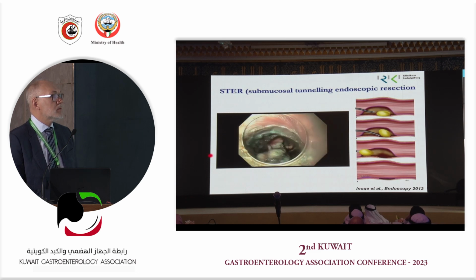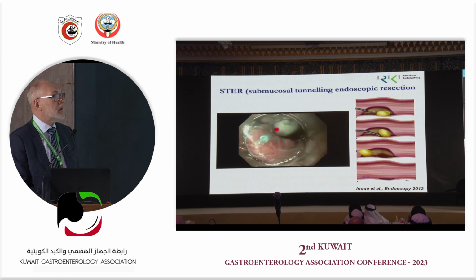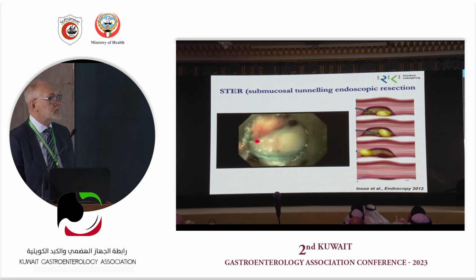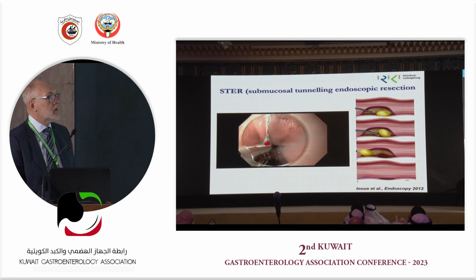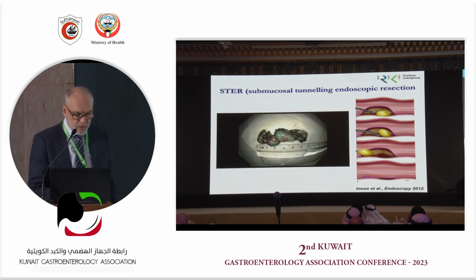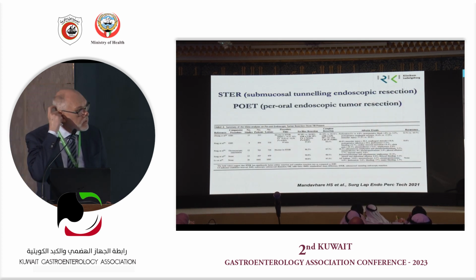It's a little bit time consuming, and finally you have everything prepared. It's actually usually very little blood. Takes a little while, but then you take it out with the snare to retrieve it, and then you clip close like in POEM, and then you have something like this, and this was a leiomyoma. So you can do it endoscopically fine, but should we do it endoscopically?